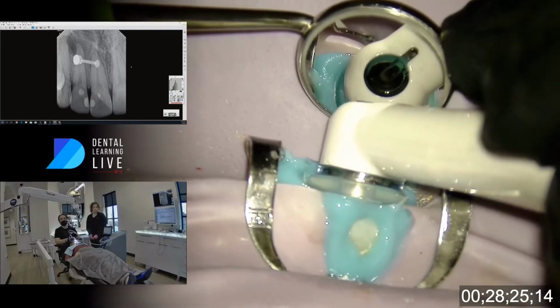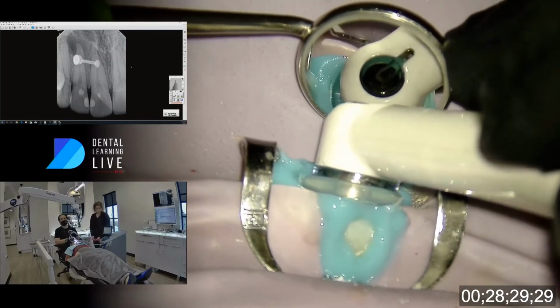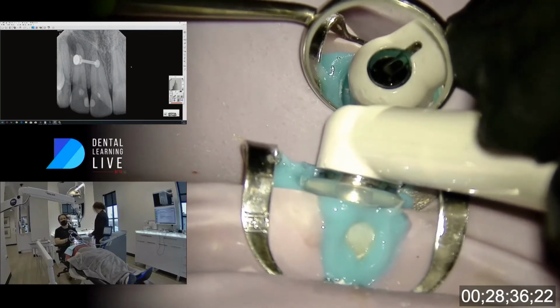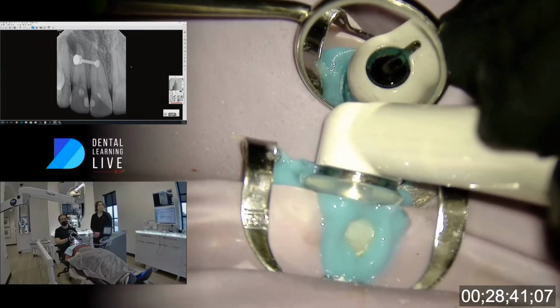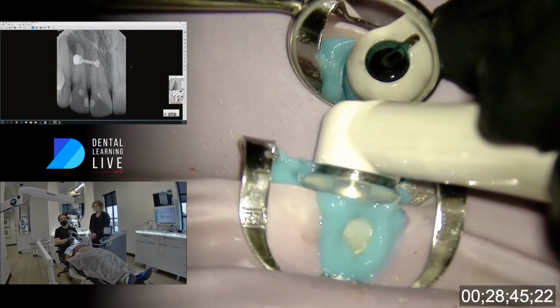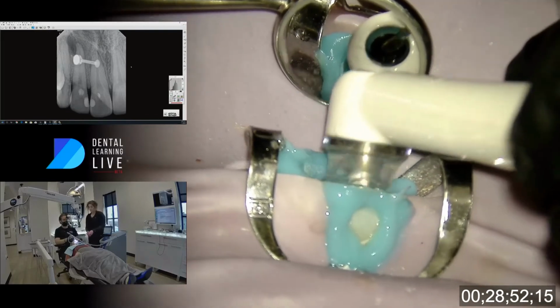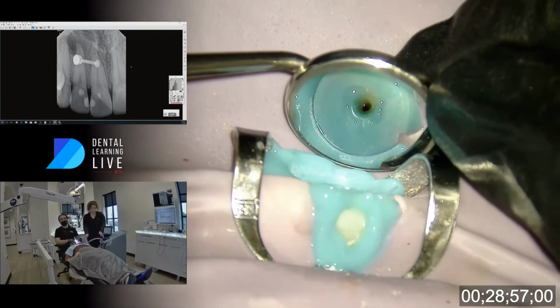If there was a crown, if there was leakage, whether it be from the sound seal or under a crown margin, again, you would see kind of a stream develop in that window, a foamy stream. The other thing is everything this is putting into the tooth, it's actually taking out. So your access size also needs to allow exhaustion. Just like in your car, we've got to exhaust what we put in so we don't get any positive pressure. So that's the aftermath. Let's take a look.